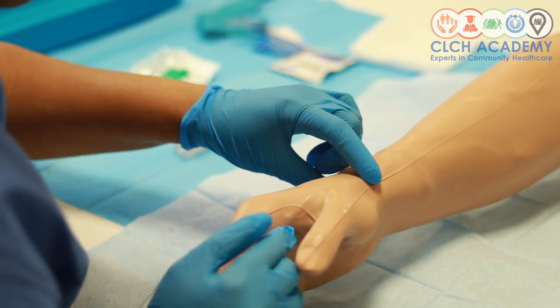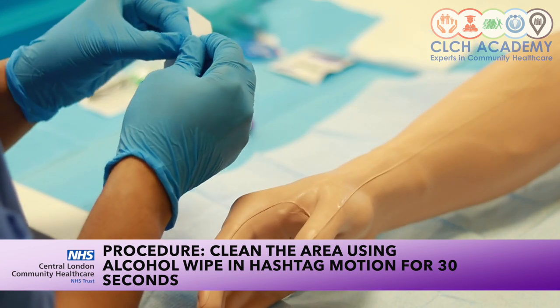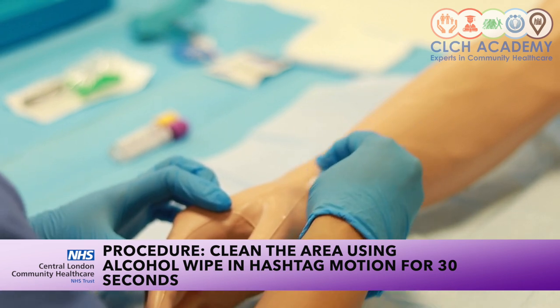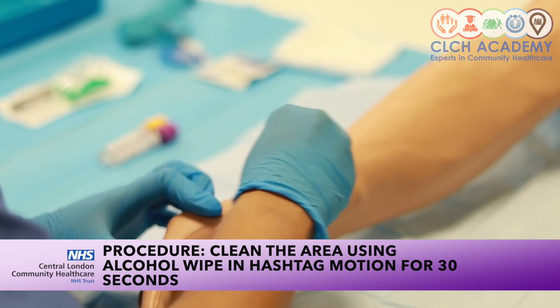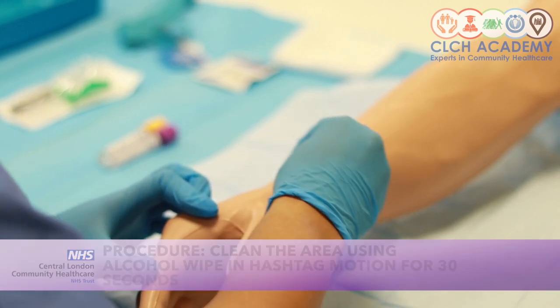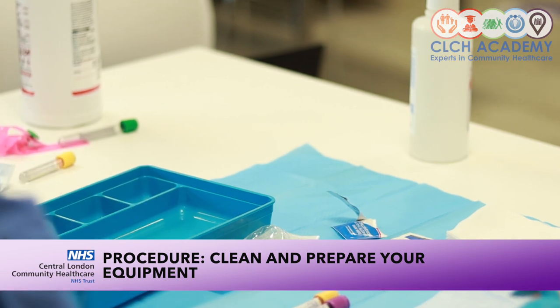It lands parallel with your thumb. And I'm just going to give that a quick clean. This time I'm using the alcohol wipe. Same technique as though I was using the ChloroPrep applicator. The position will be up and down for approximately a region of 5 to 10 centimeters, and then across, just to really get into the grooves of the skin and decontaminate that region. And we're going to be doing this for 30 seconds. All right, dispose of rubbish in the bin.